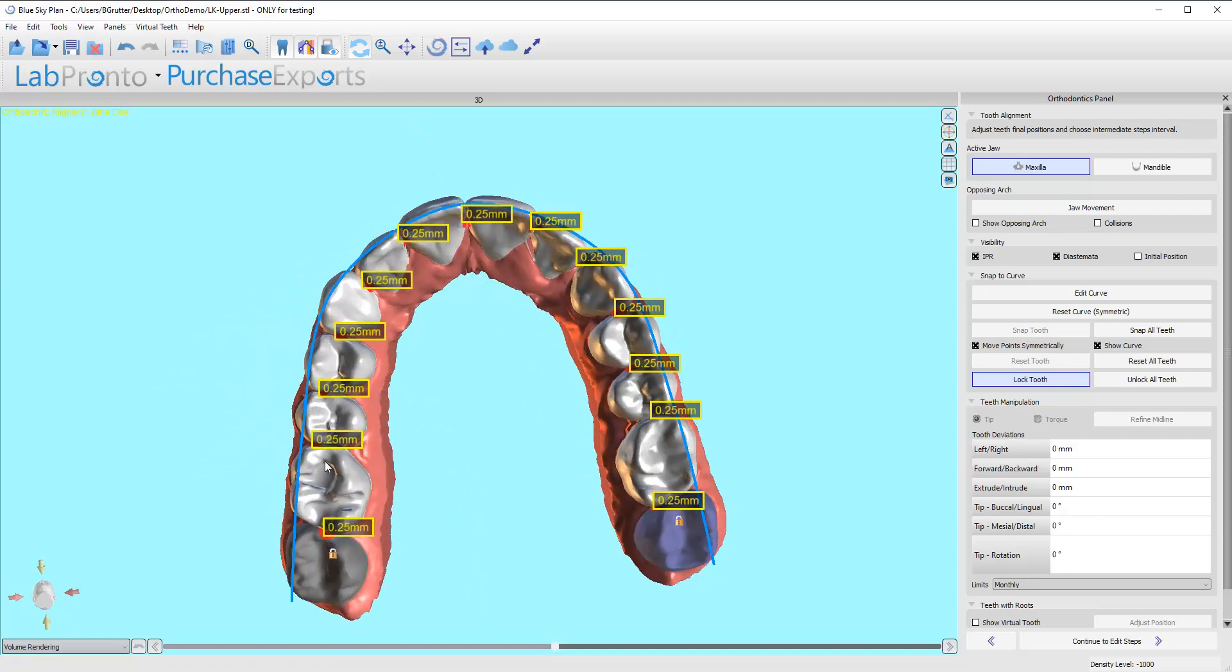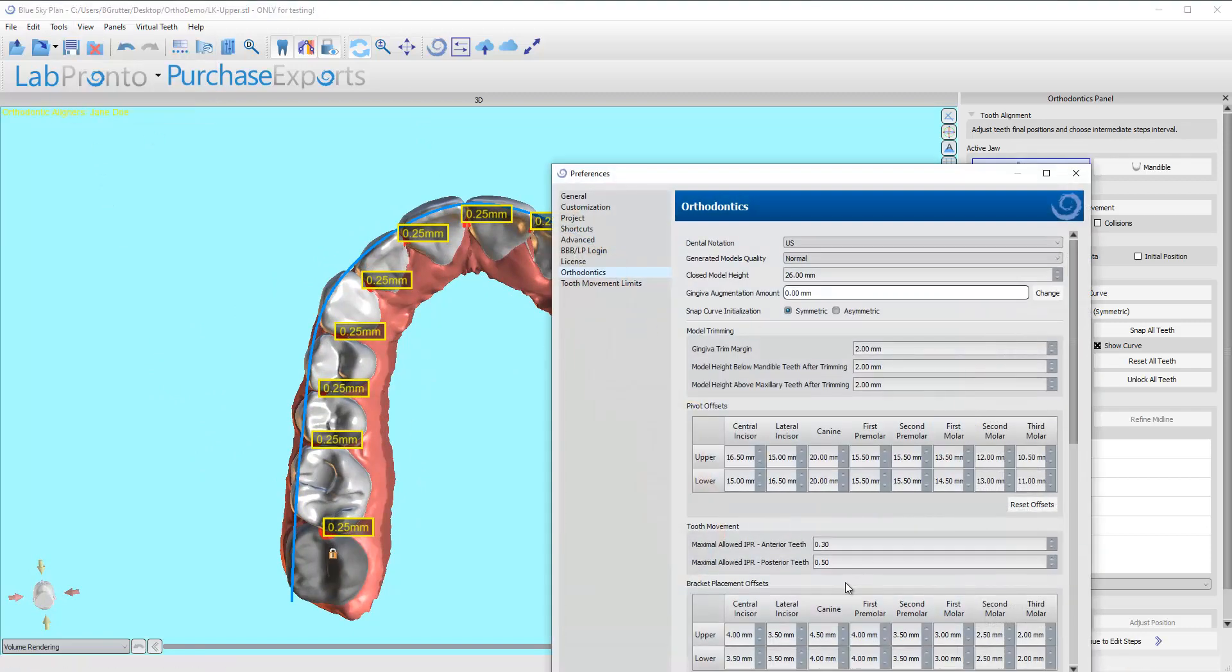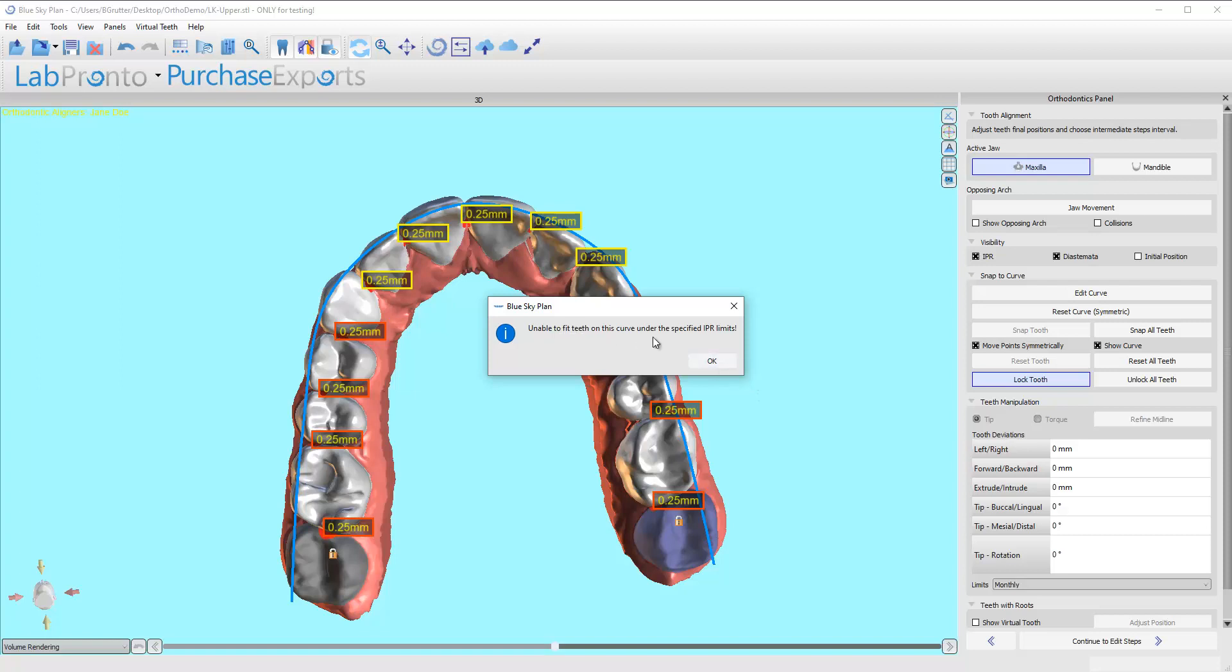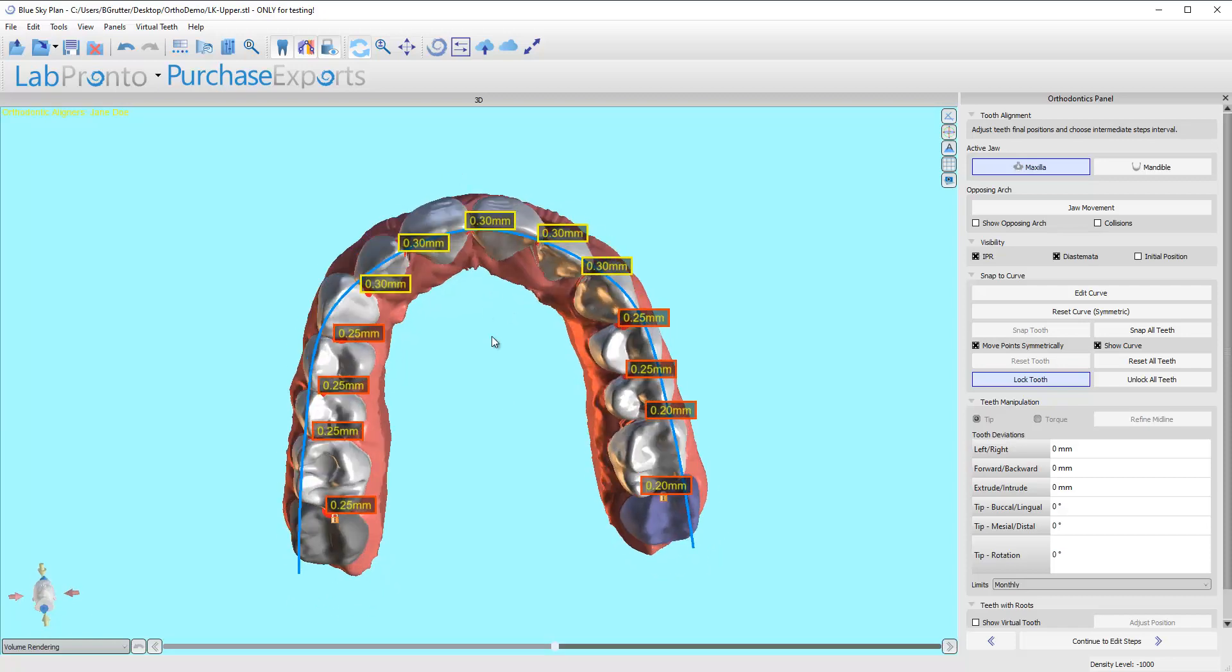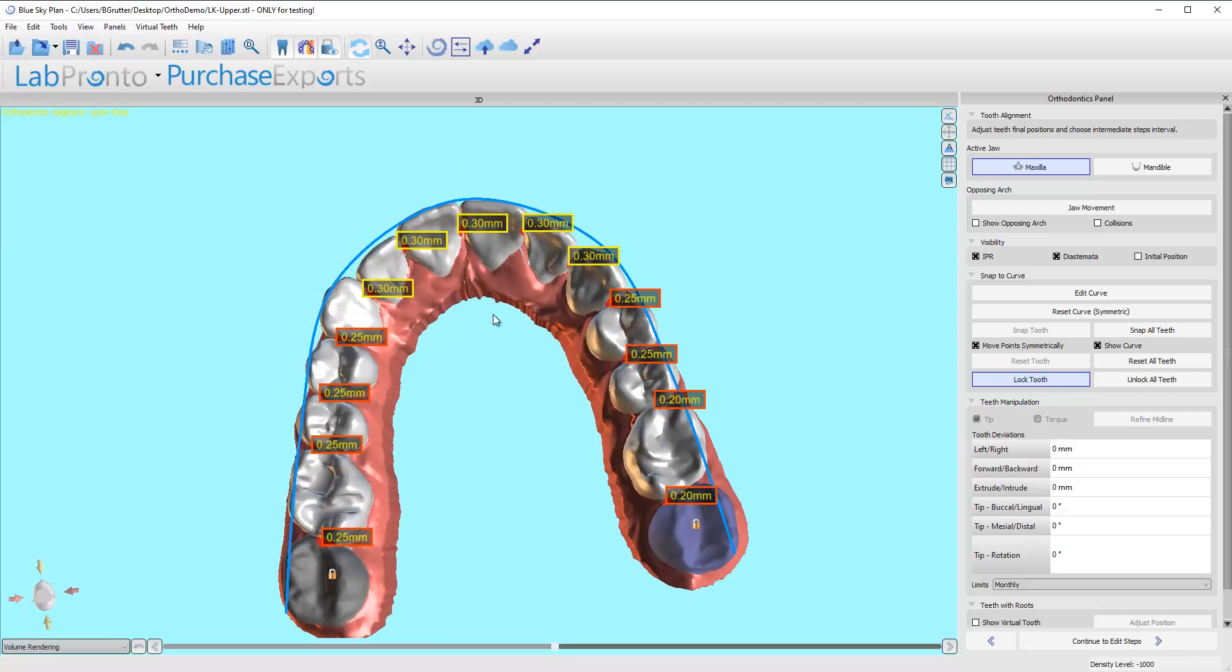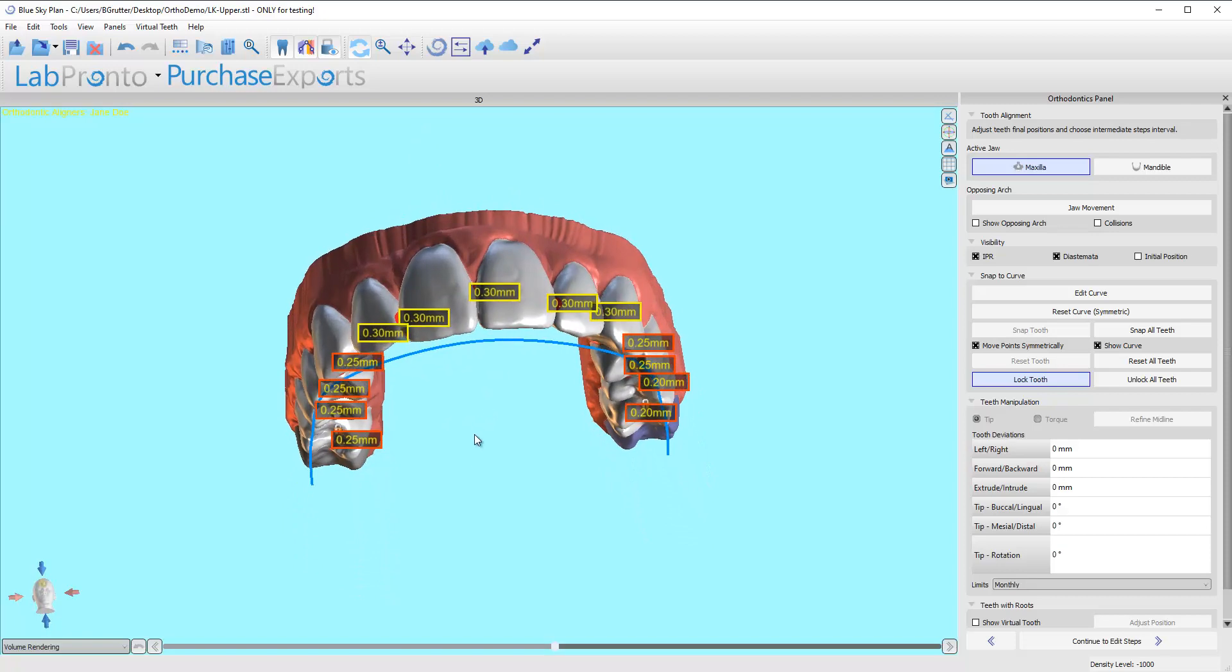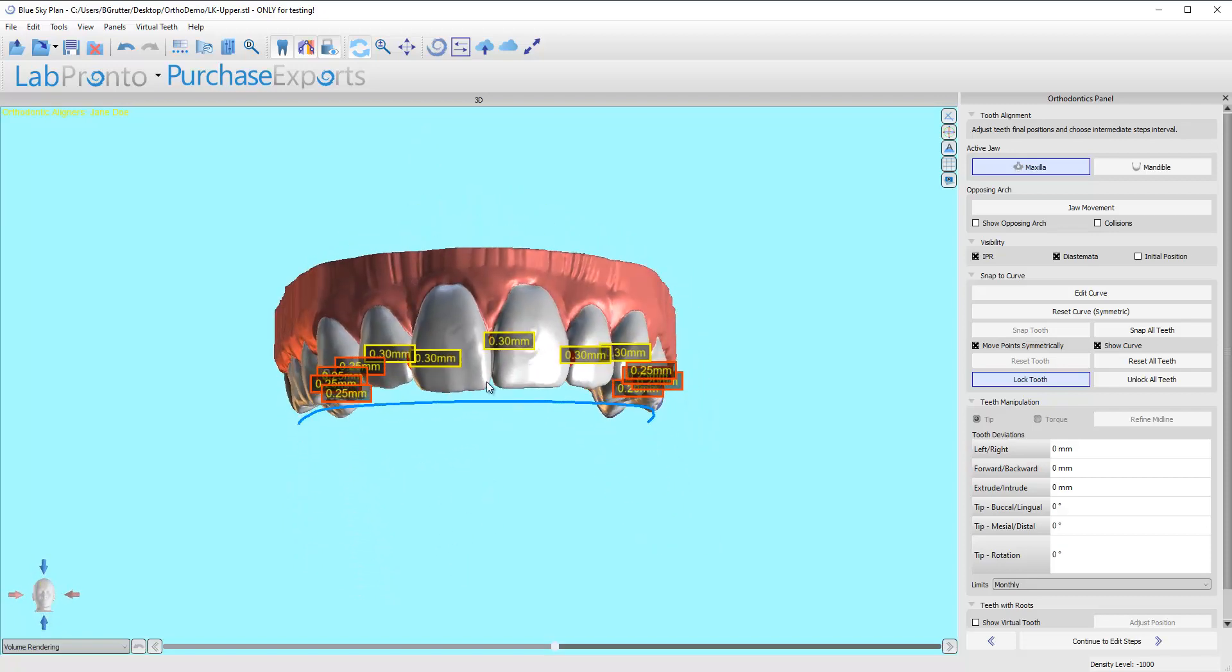If you wanted to say no, I don't like doing posterior IPR, you could come up here, go to preferences, and dial this one down—let's just say to 0.1. Now let's click snap all teeth and it should try to front-load. See, it gave me a warning—it's still going to do it, but it says it's 0.3 in the anterior where I told it no more than 0.3. It exceeded in the posterior because it needed to get some IPR somewhere, so it maxed out the anterior and exceeded in the posterior. Again, you can move those numbers around all you want.